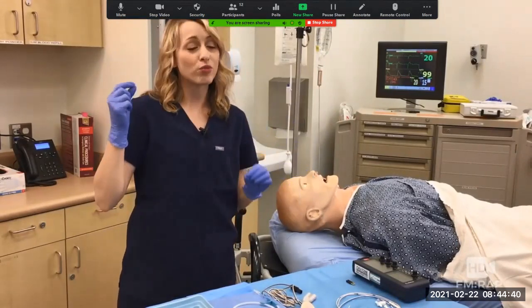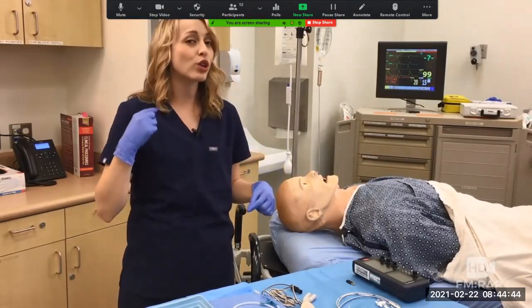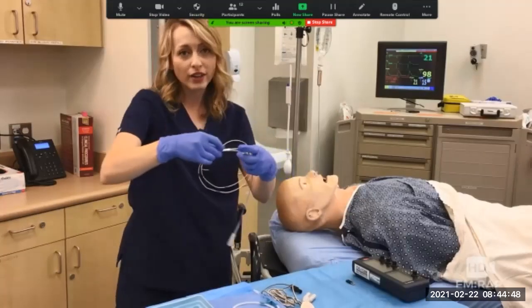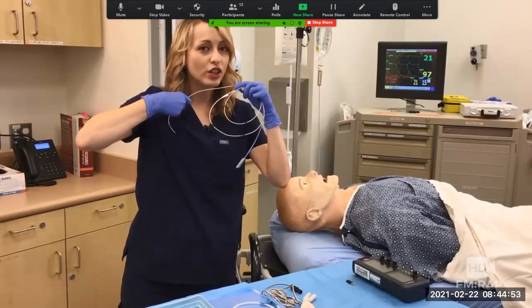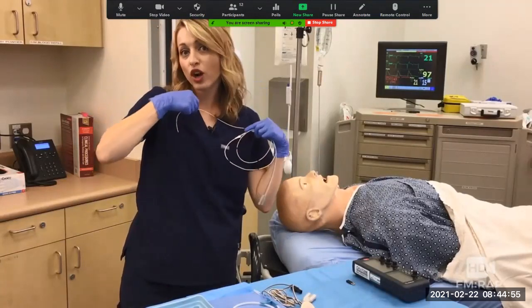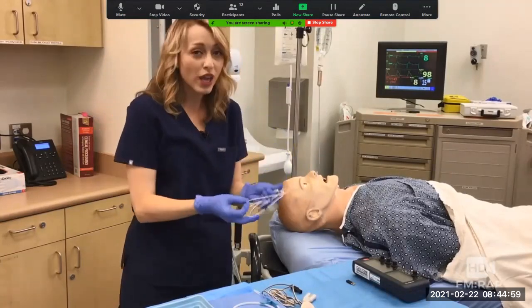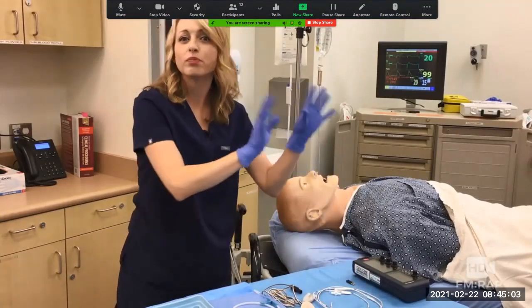Now we want to use either the right IJ or the left subclavian as the preferred sites because they're the closest to get to the heart, but also check this out. That curvature of the wire, we're going to use that to our advantage. So if you go through the right IJ, it's going to curve towards the heart. And if you're coming across the left subclavian, again, it's curving towards the heart. If you can, use the right IJ instead of the left subclavian so we can use that for the permanent pacemaker.